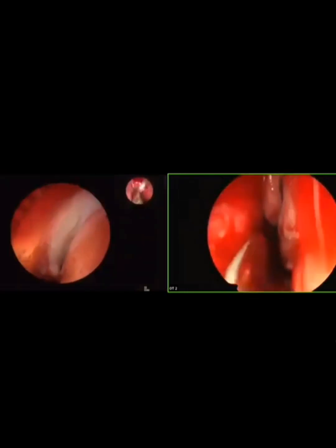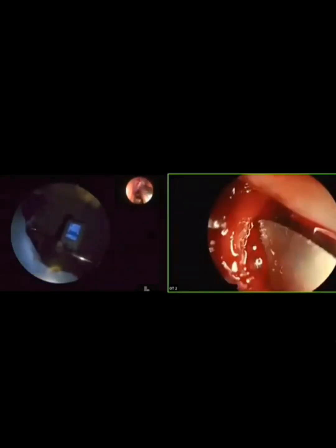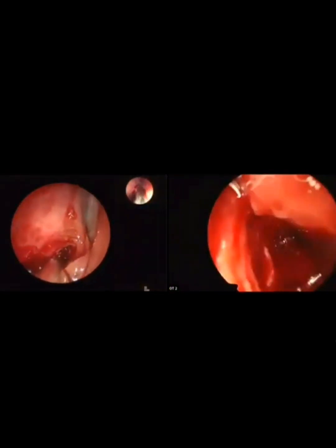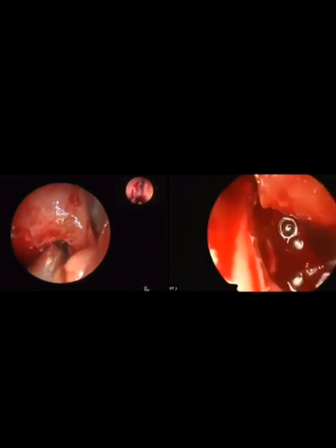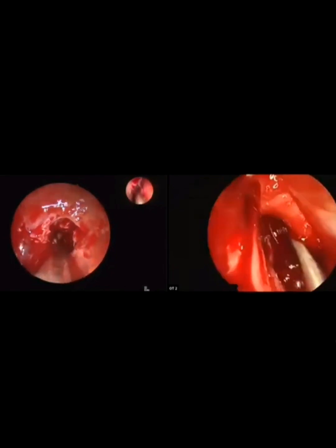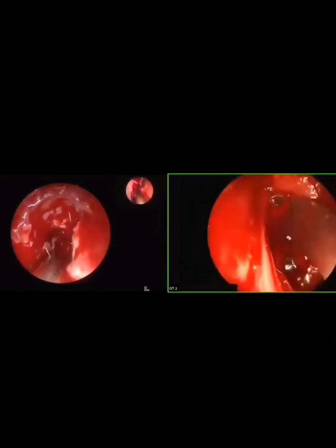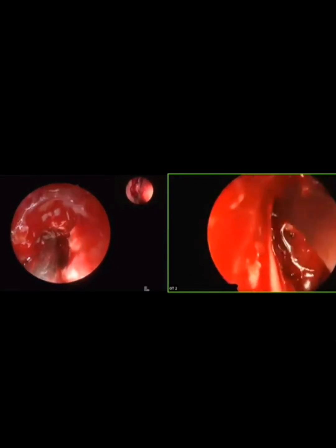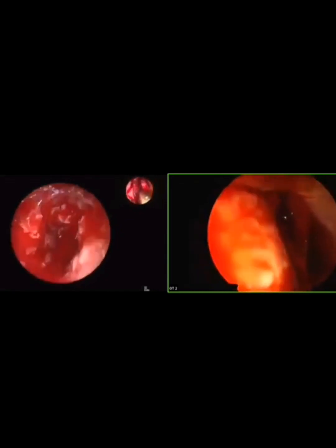Chaitri, you told you kept the L strut of the septal quadrilateral cartilage. So what should be the proper length and width of that cartilage to be kept? Approximately 2 to 2.5 centimeters, dorsally and caudally. Superiorly, I have just removed the part which was deviated; I had not gone upwards. Anteriorly I had kept 1 centimeter.